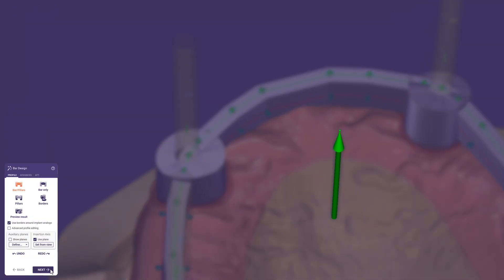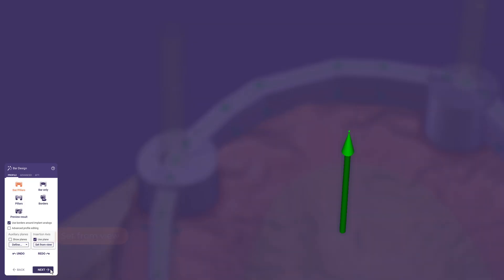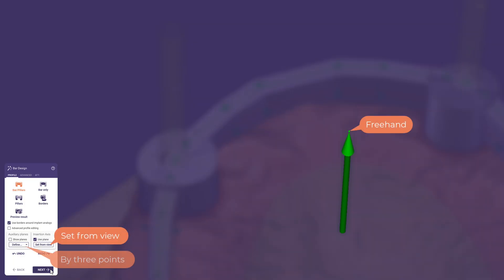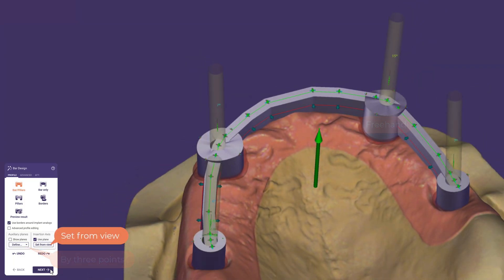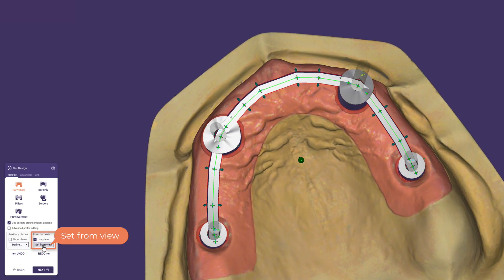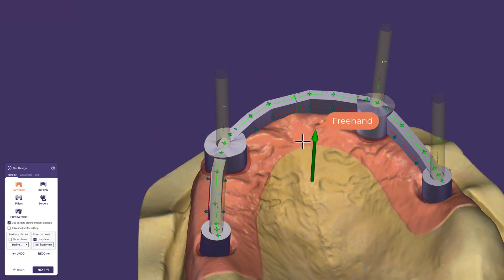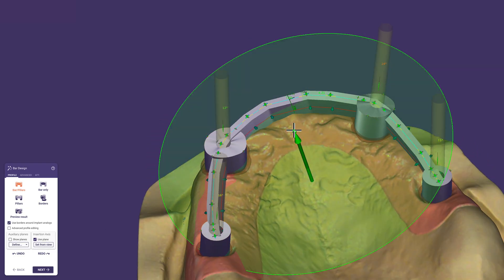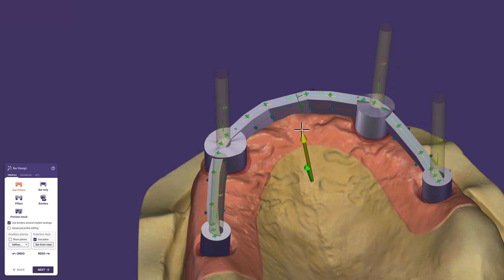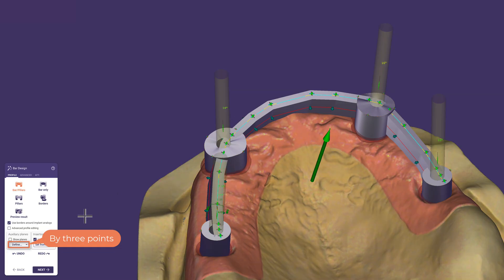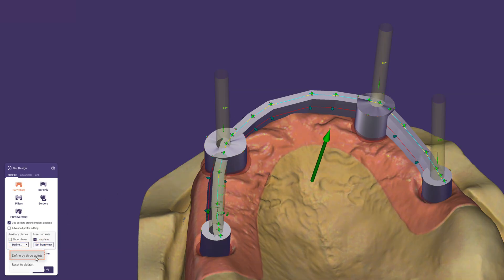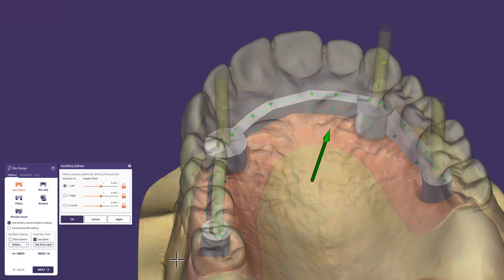Before we start the design we need to define the insertion axis of the bar. Three different options are available: first, by utilizing the view to define it and clicking the 'Set from view' button; second, freehand by simply dragging the tip of the green arrow; and third, by using the button 'Define by three points' on the gingiva or even better on the pre-op scan if available.